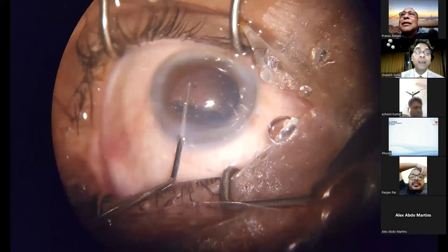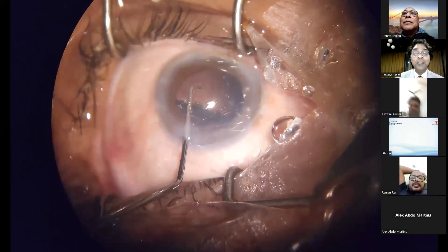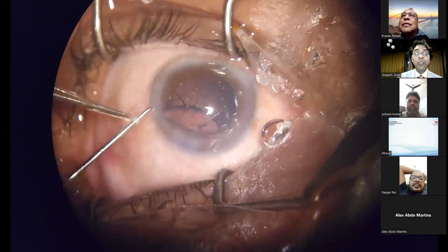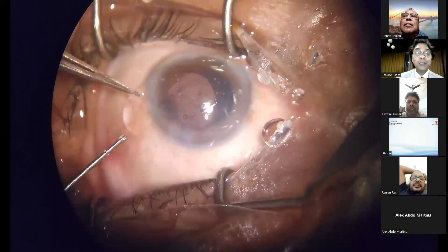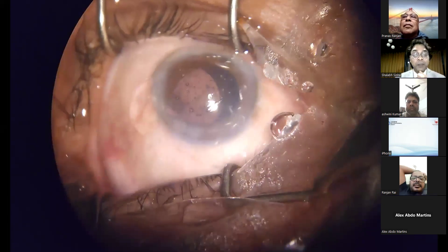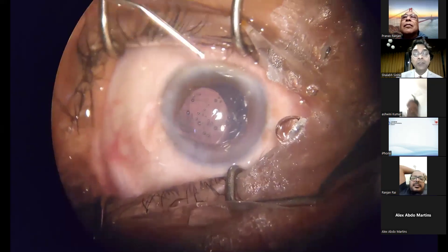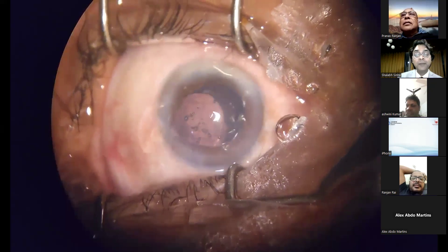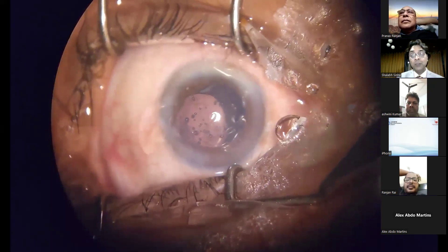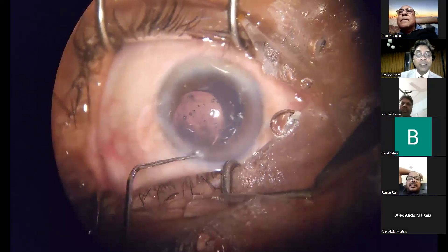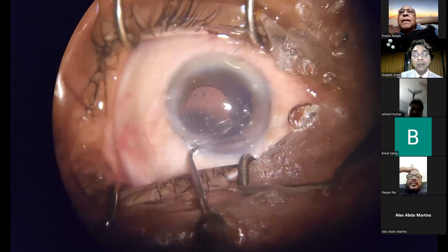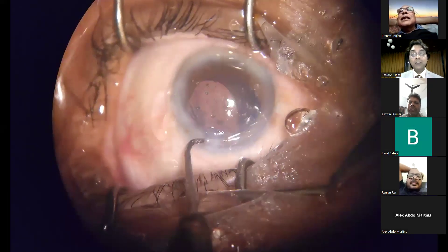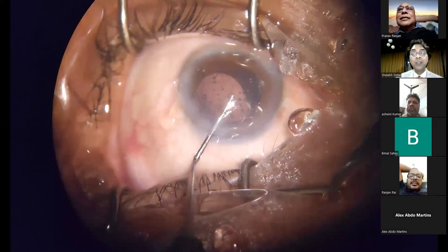In my left hand I have the Kuglen hook; in my right hand I have a Sinsky hook keeping the lens in the anterior chamber. Since the lens is not going into the sulcus, I decided one haptic must come out to prevent it from going down. Using the Kuglen hook, the leading haptic is pulled and brought above the iris, then slowly placed in the sulcus. The trailing haptic is also dialed into the sulcus.